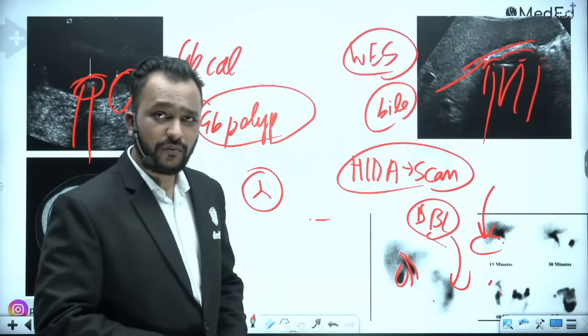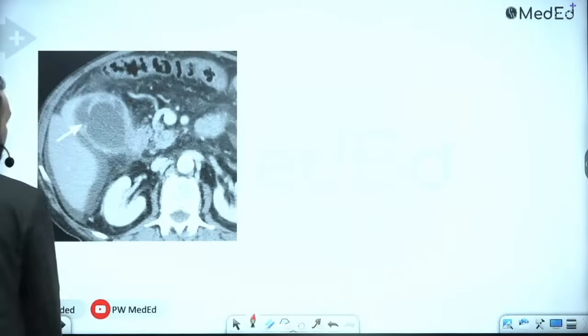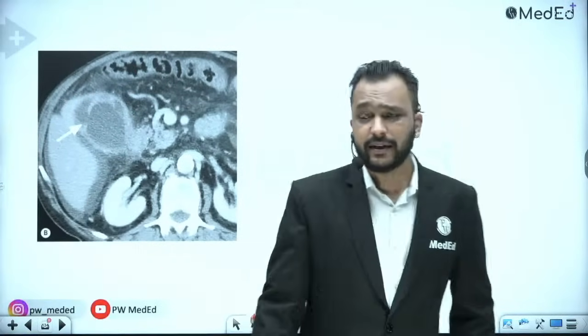That will be a case of biliary atresia, right?